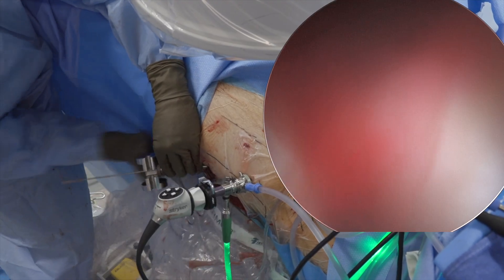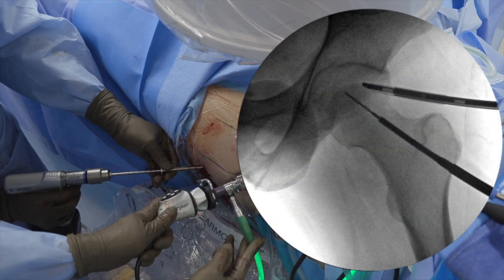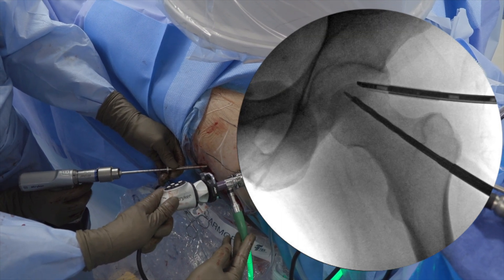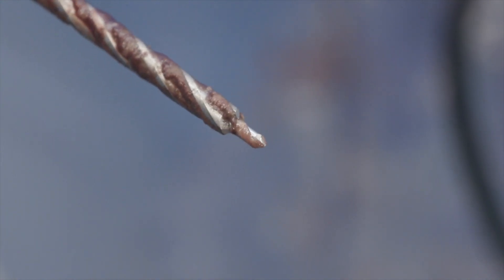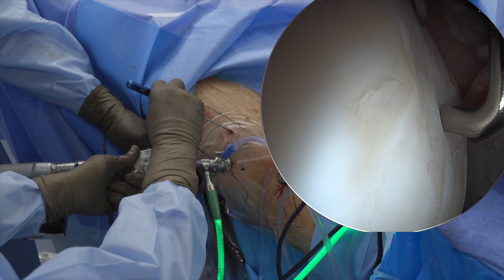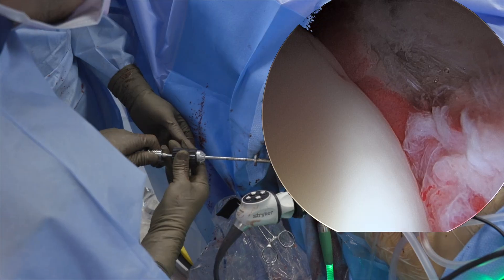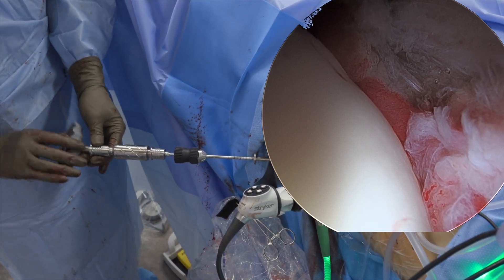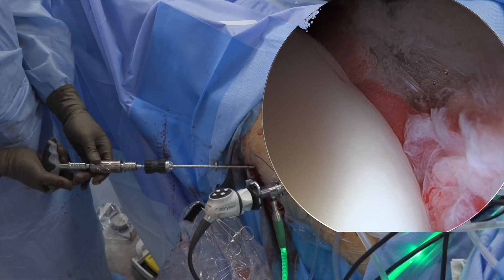The cannula from the targeting device was then notched into the lateral femur to allow for instrument exchange. A 5 mm reamer was then used over the guide pin to the appropriate depth under fluoroscopy. Note that the reamer does not go all the way to the end of the guide wire, but rather to 10 mm from the tip of the guide wire. Integrity of the cartilage was checked. The expandable hand reamer was then inserted to complete the core decompression all the way through the necrotic bone. The reamer was started at 6 mm in diameter with a torque limiter and gradually expanded to 18 mm while checking to ensure that the cartilage surface remained intact.